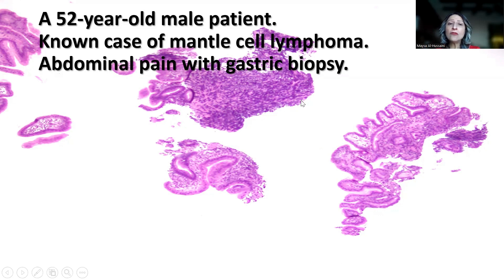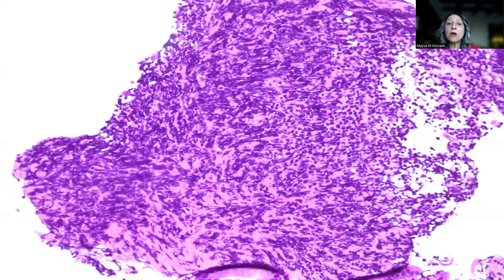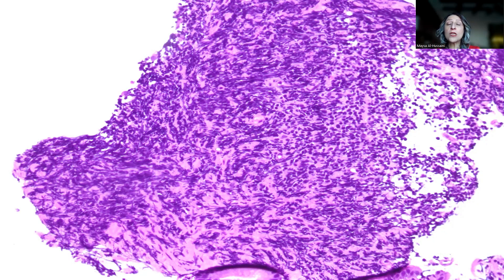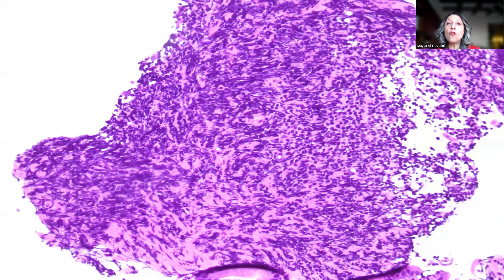Because the involvement was not diffuse, and because of the marked crushing artifact, it might not be suspicious, especially for a junior pathologist. But actually, the trick is here: when you encounter marked crushing artifact in what appears to be a lymphoid aggregate, you have to be suspicious, whether the patient is a known case of lymphoma or otherwise.